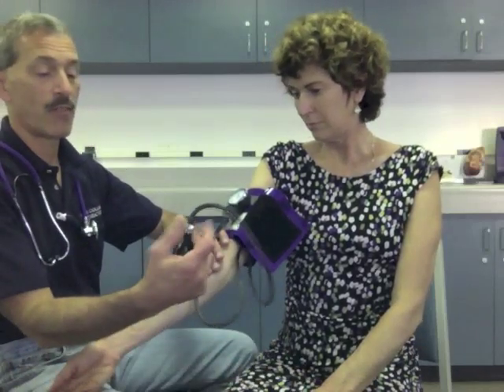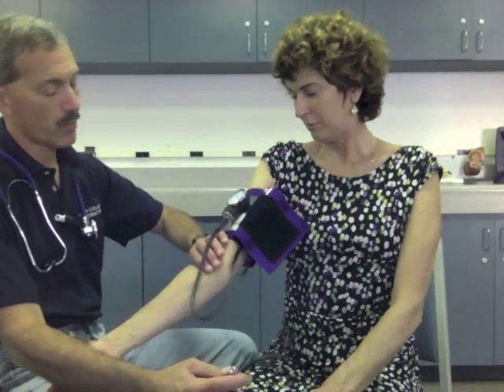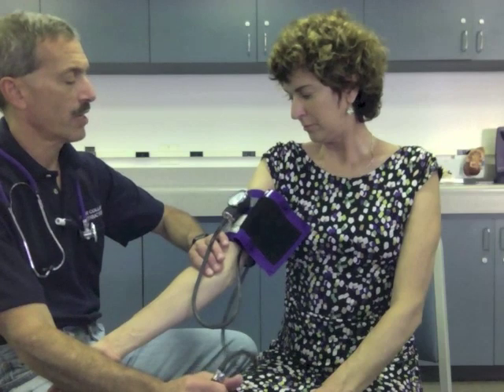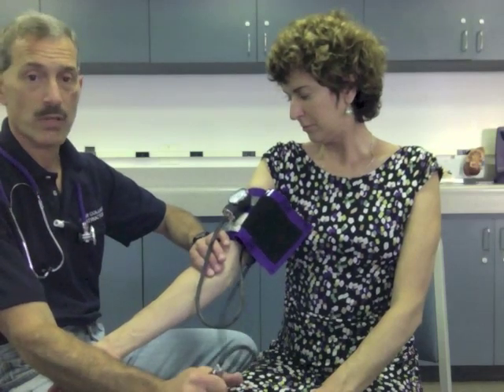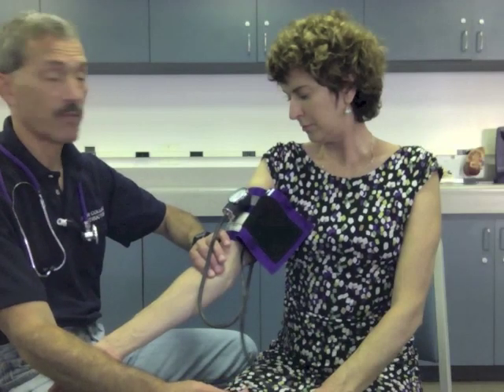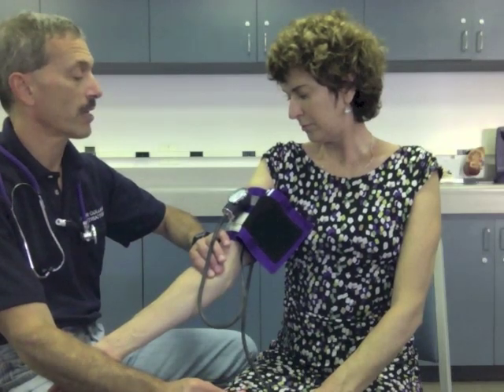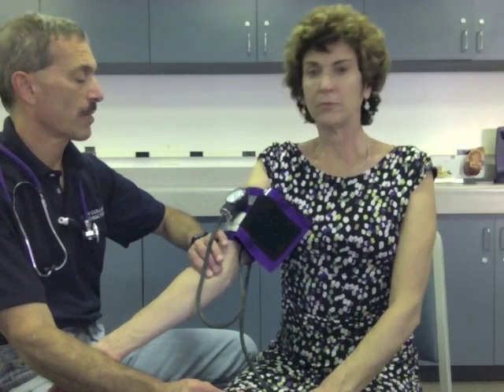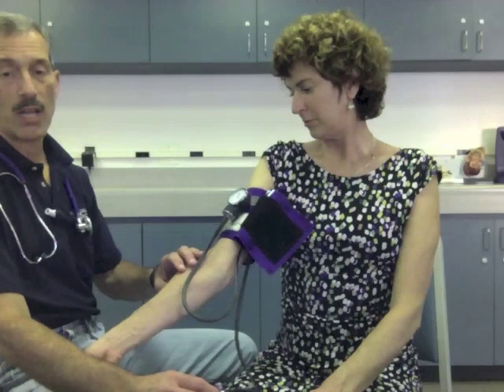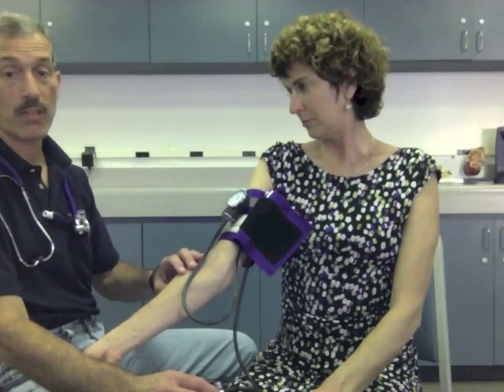I'll ensure it's approximately one inch above the antecubital space and that the artery arrow points towards the brachial artery I found. Next I'm going to turn the valve off all the way to the right. I'm going to re-obtain that pulse under my fingertips, inflate the cuff until that pulse disappears, inflate about another 30 points, stop inflating, then start deflating slowly. I'm going to feel for the return of that pulse and note that on the dial. Once I obtain that number, I'm going to let all the air out for patient comfort. Patient has a systolic blood pressure of 90 by palpation.